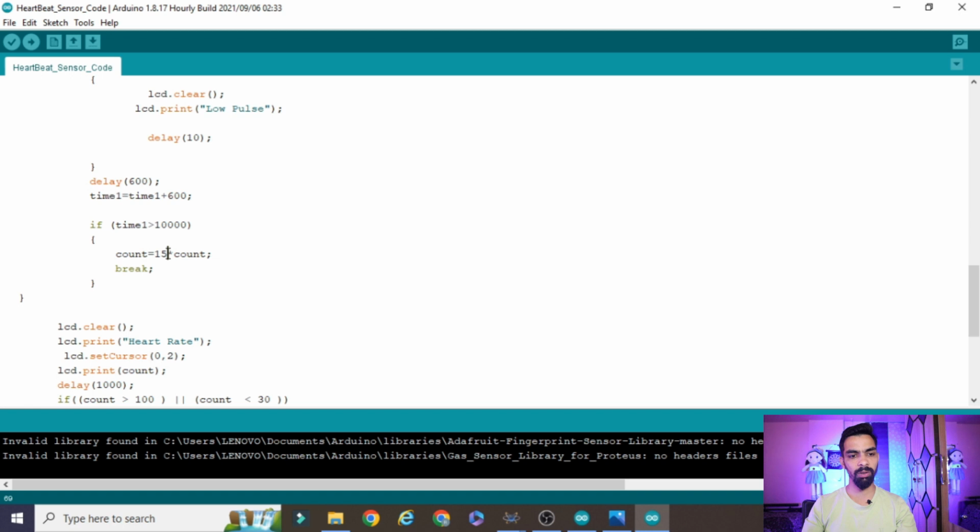If you do not want to multiply this count, you can increase this to 60 seconds, 60,000 milliseconds, that means 60 seconds, and then you do not need to multiply. Whatever count you receive will be stored, and that is the real-time count for 1 minute. I don't want to wait for the 1 minute, that's why I multiply the count by 15. Here I am just taking the count for 10 seconds and multiplying by 15. So I told you where to change the logic if you want to wait for the 1 minute completely. Now I will wait for 10 seconds, and whatever count I get I will multiply by 15. So the final count I will get here.